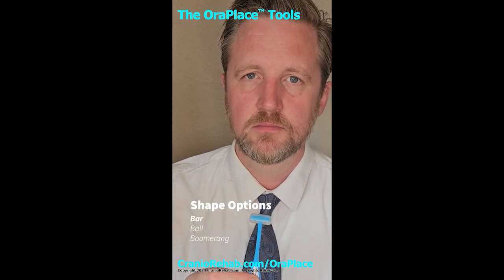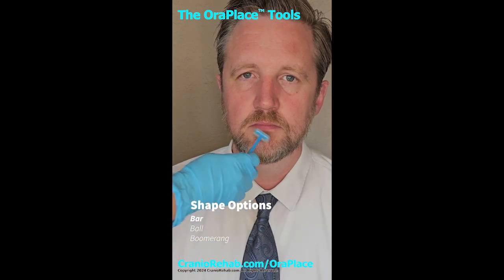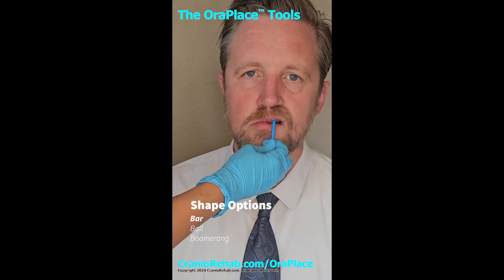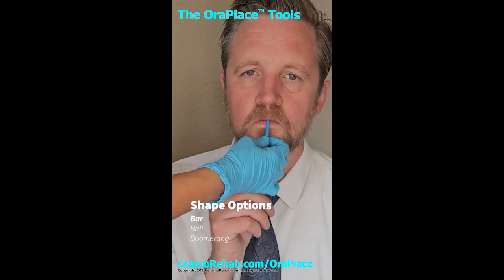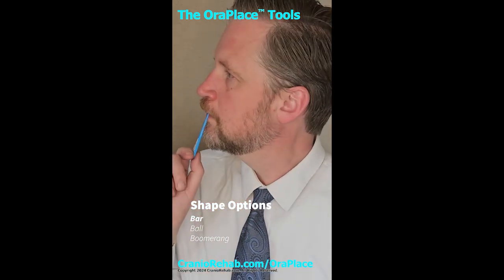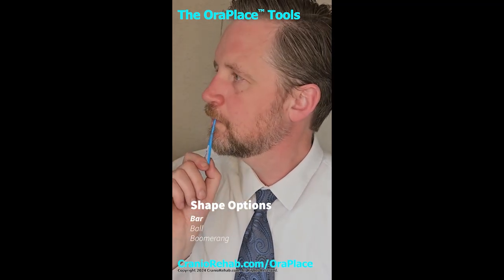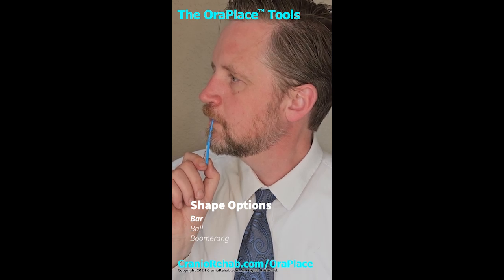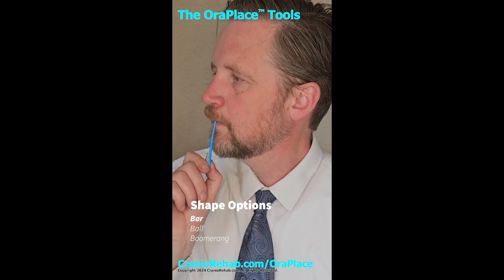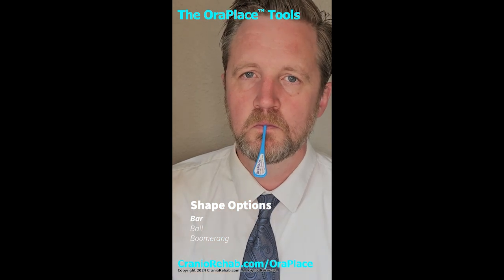To target the upper lip, place the tool underneath the lip to provide a nice, easy stretch. Okay, Rob, go ahead and turn your head to the side. Is this uncomfortable? No. Is this painful? The patient should not experience pain or discomfort during this stretch. Our goal is to have this in as long as possible. Depending on the patient, they can sit and hold the tool in place, or we can hold it for them. Sometimes it will stay in place on its own.